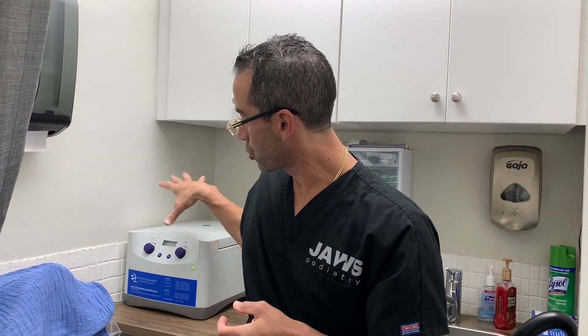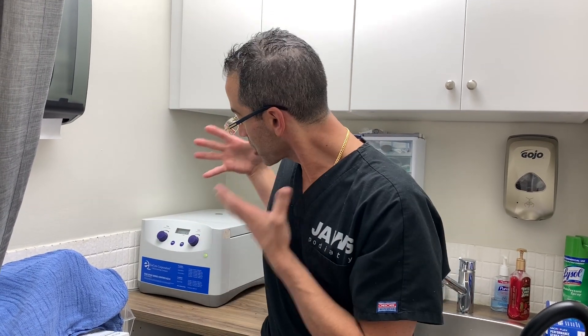Right now we drew quite a bit of blood from the patient and we're already spinning it. The first part: we draw the blood. The second part: we centrifuge the blood. When we centrifuge the blood, the purpose is to have the blood separate into good and bad. The bad we throw away and the good we keep. The good — the PRP, the platelet-rich plasma — contains growth factors, important cells that aid in the regeneration of damaged tissue, and it lowers inflammation long-term.